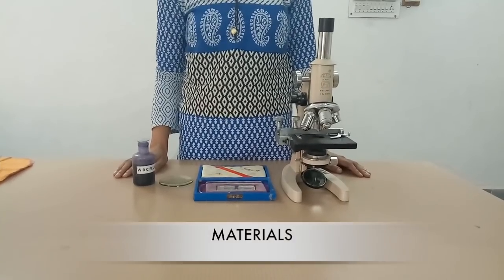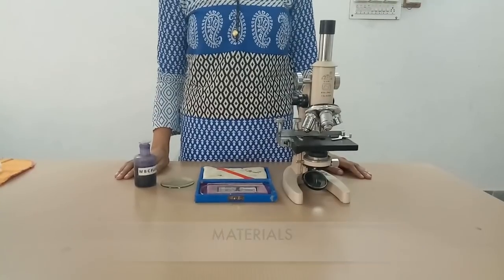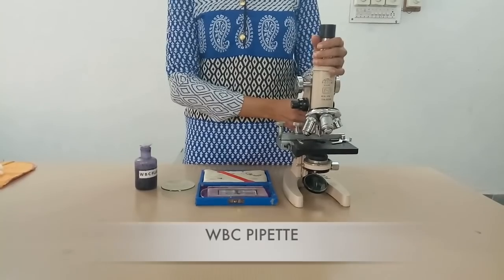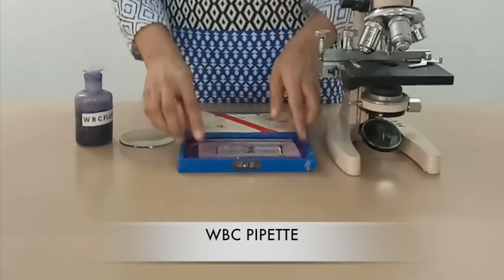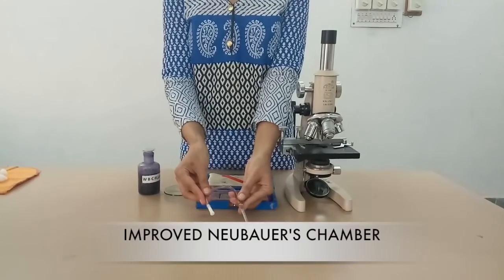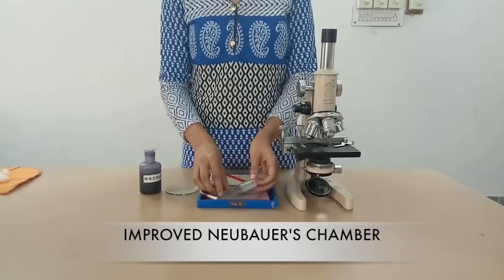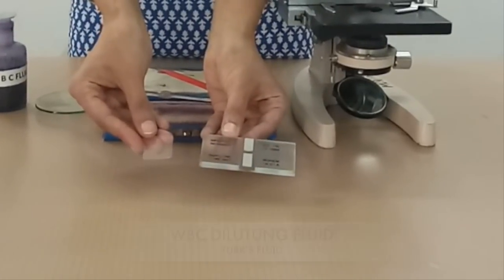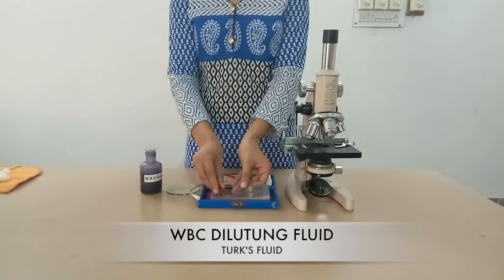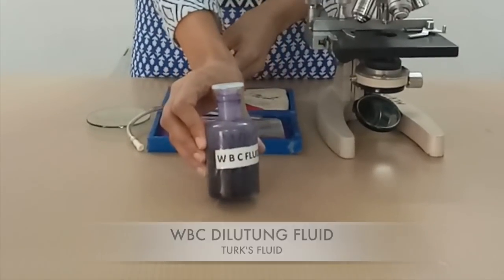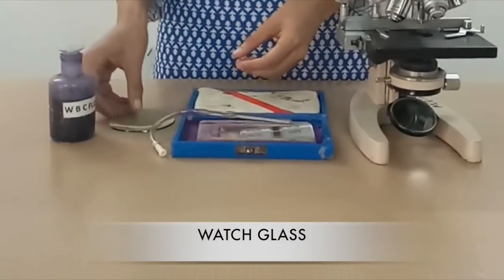Starting with materials, for WBC count we require microscope, WBC pipette - here is the WBC pipette, improved Neubauer chamber and coverslip, WBC diluting fluid also known as Turk's fluid, and watch glass.